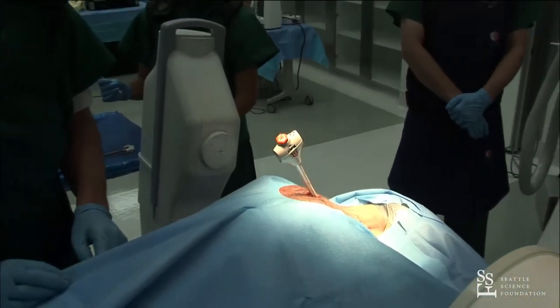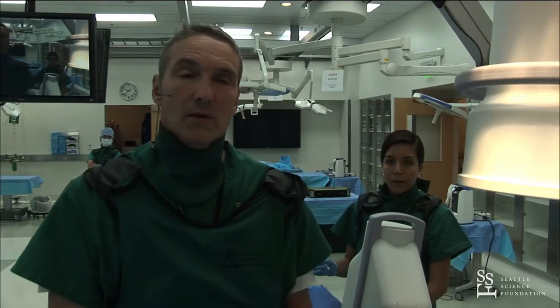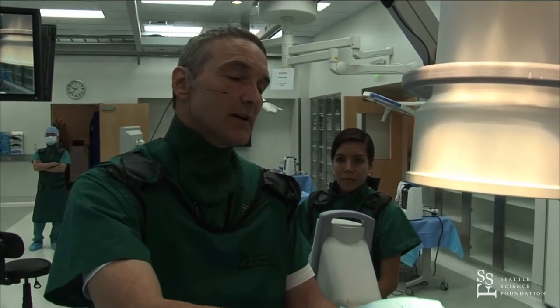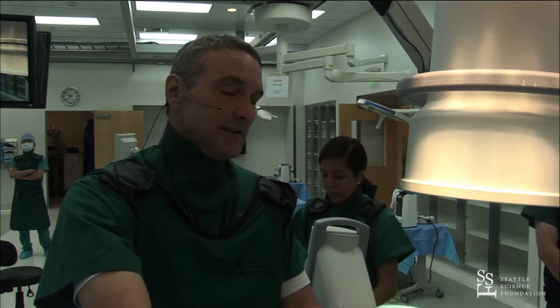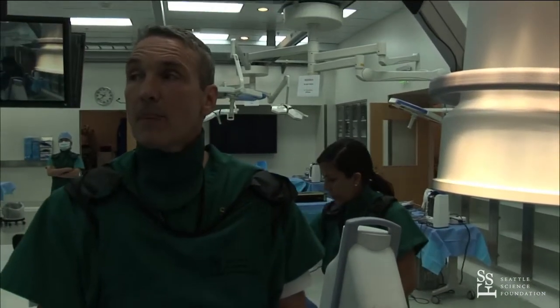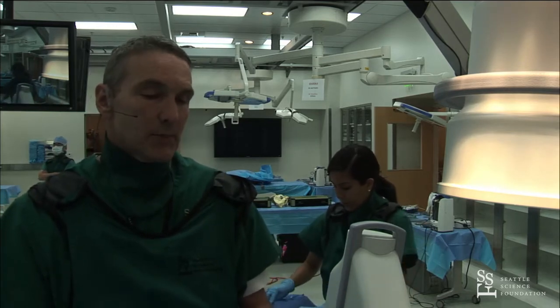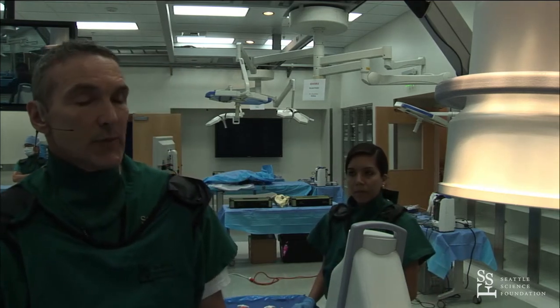Is there any chance you could actually experience a pedicle fracture if you're too aggressive? I suppose so — I haven't seen that or heard of that. It's like anything else; there's some skill to it. It's not real hard malleting — we're not in the lumbar spine, so it requires some discretion. If you're medial, then you're going to hit the pedicle. But if you're more lateral in the lateral half of the lateral mass, presumably you can go anterior — couldn't you? No. The only level you can do that on is at C6-7 and C7-T1. At C3-4, C4-5, C5-6, you're always going to run into the pedicle no matter how lateral.